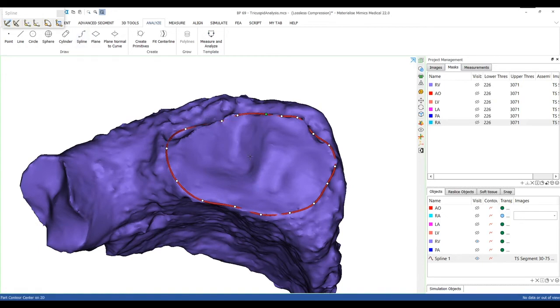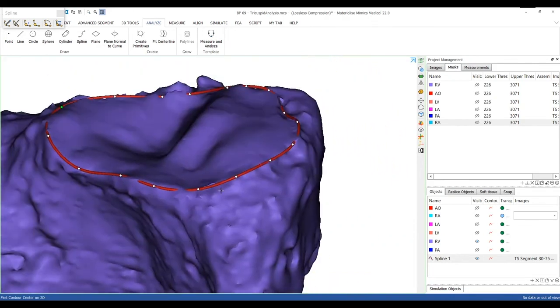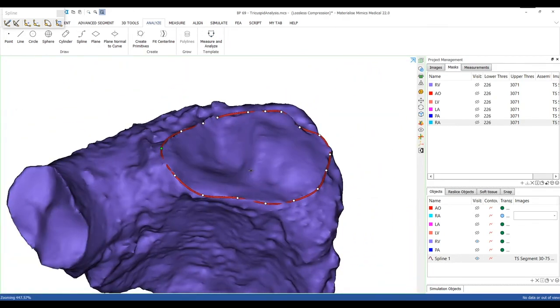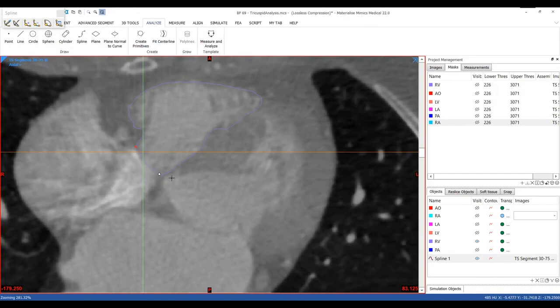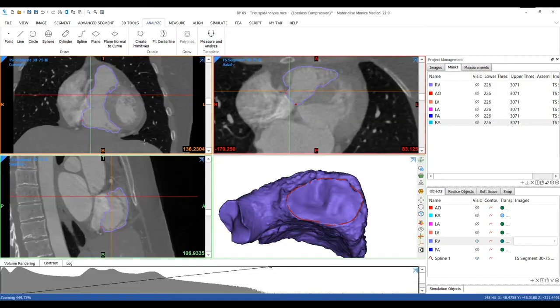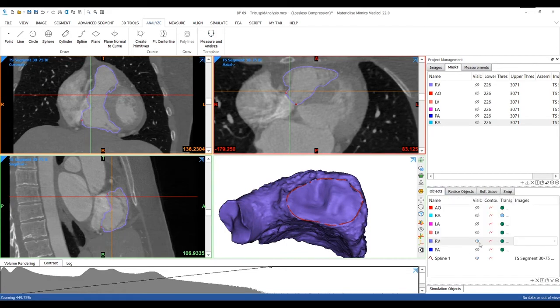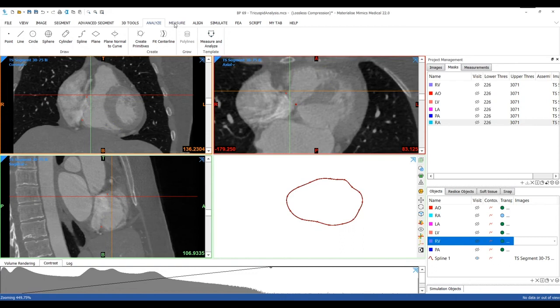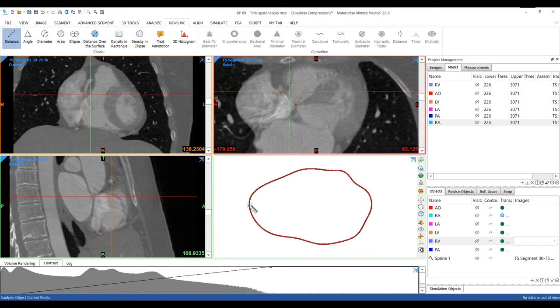Double click at the last point to close the spline. Then you can edit your contour both on the 3D model by rotating around and dragging your control points, or on the images. Then you can immediately make any measurements between any points on the spline. Make sure the snap options are toggled on. You hide everything except for the spline. Go to the Measure menu and select the Distance tool, and then click between any of the interested points on the spline.